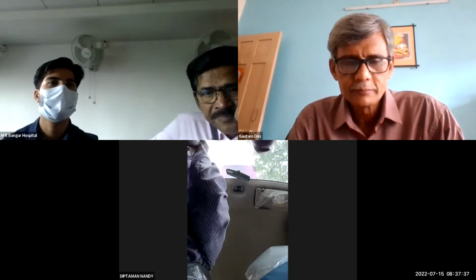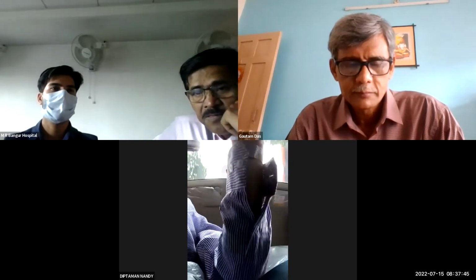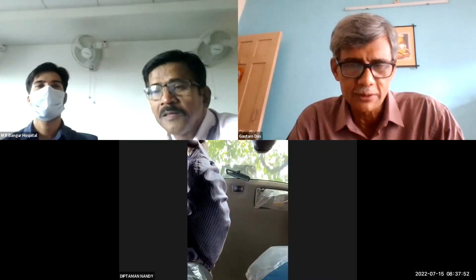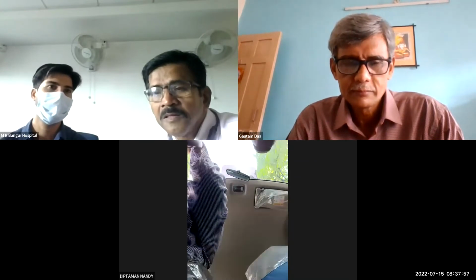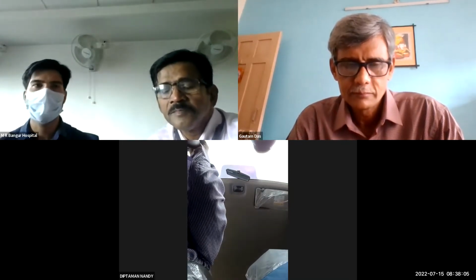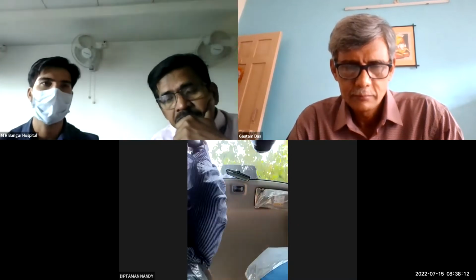Then we will start dissecting. You have held this fundus. You have held the Hartmann's pouch. What is the direction of the force of these two instruments? Fundus of the gallbladder should be retracted upward and outward toward the right shoulder, and Hartmann's area should be retracted downward and outwards.